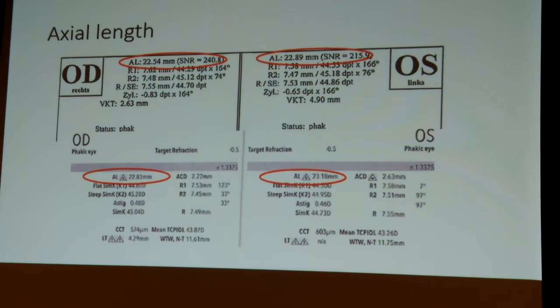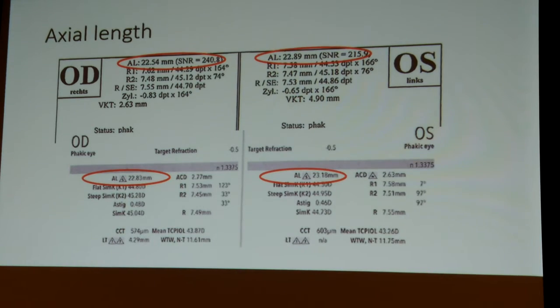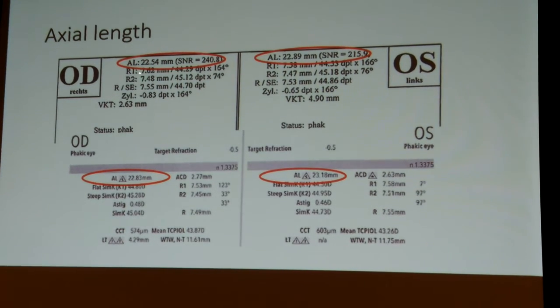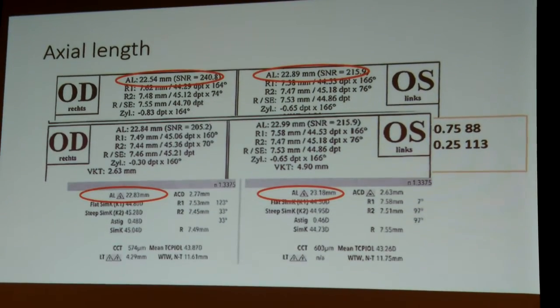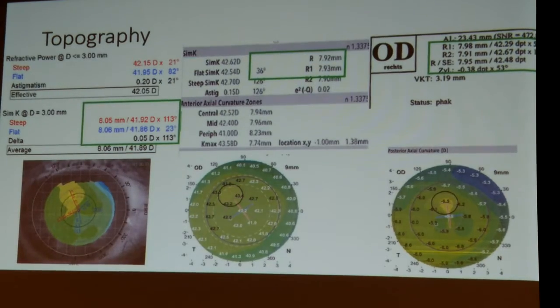So in the biometry clinic, as you see, we use all our devices. We use for axial length the IOL Master and the Galilei, just because of probability, statistics, one measurement is non-measurement. So we repeat all the measurements. That is an example, just to make sure we don't have any measurement error. So that's the same patient, 22.5, 22.8, same patient on the other eye is completely the opposite. So something's wrong. If you don't do your measurements several times with different machines, you don't know which is right. So we repeat it, and then we get the right numbers, and then we are sure that we know what we have in front of us.